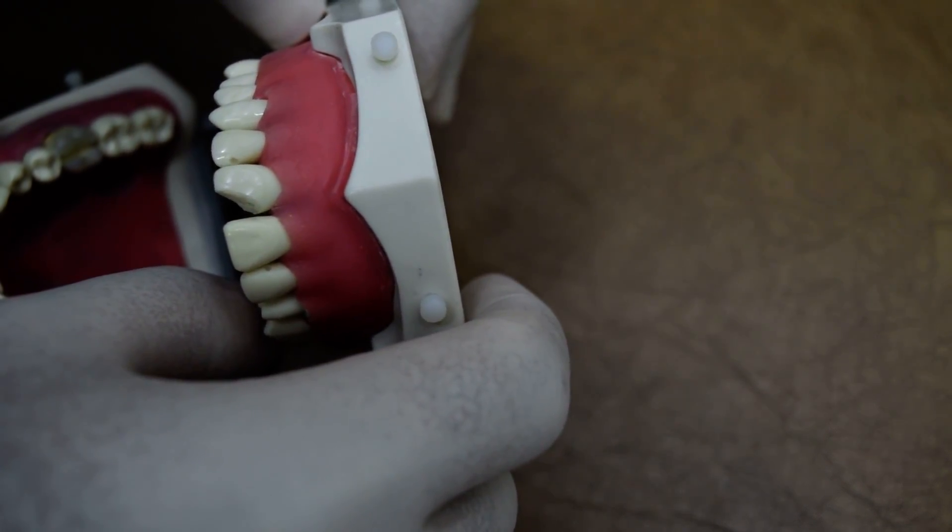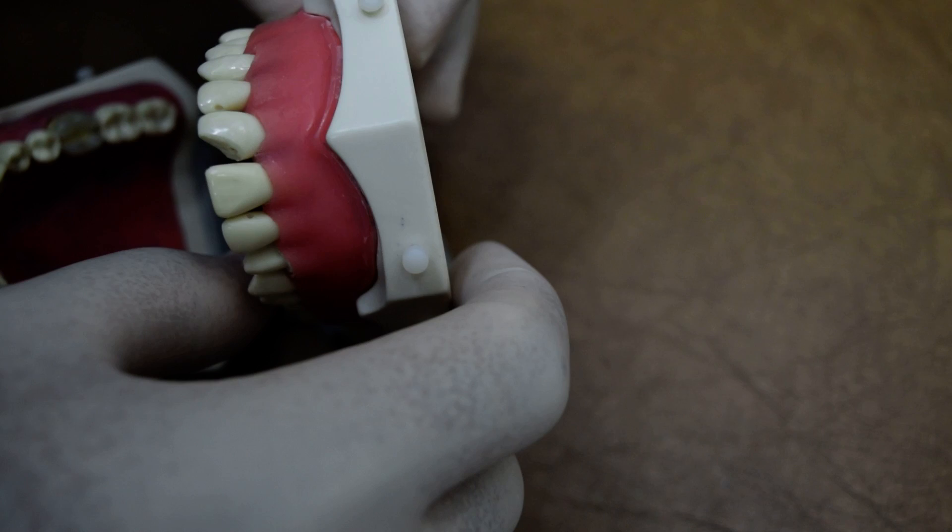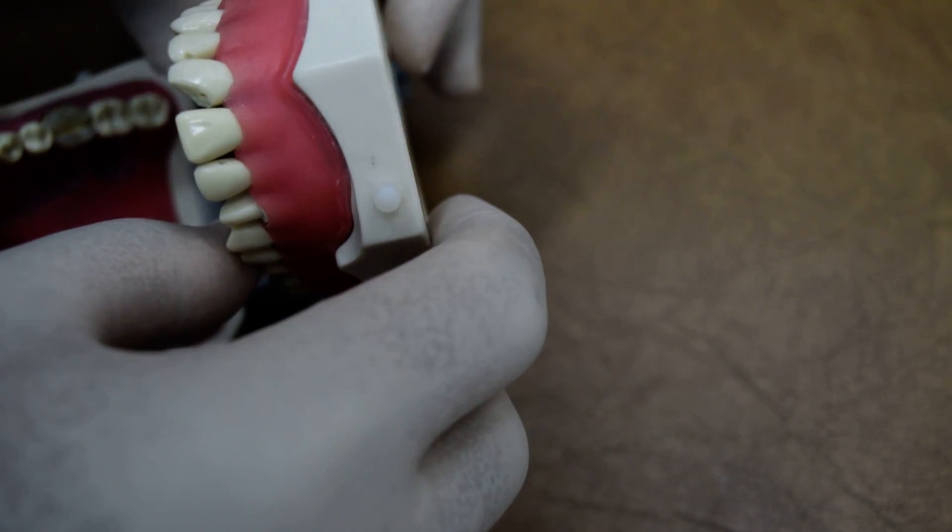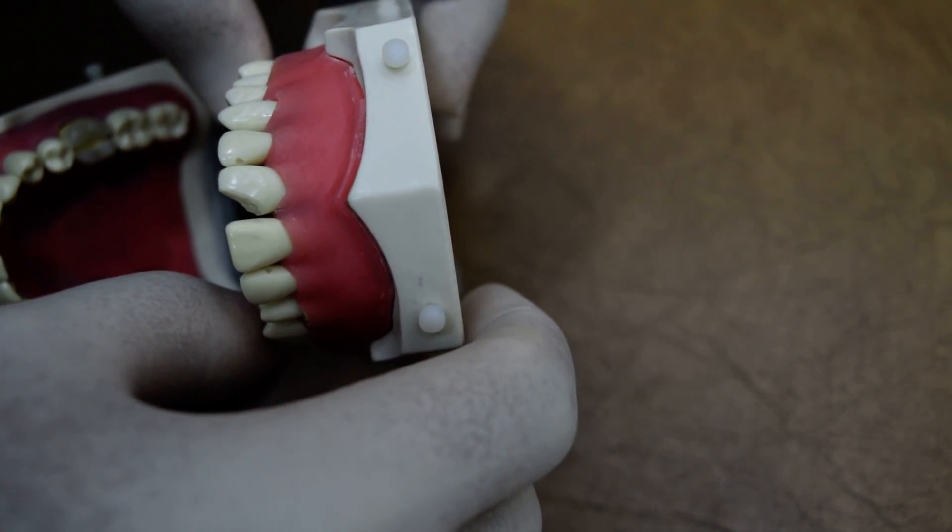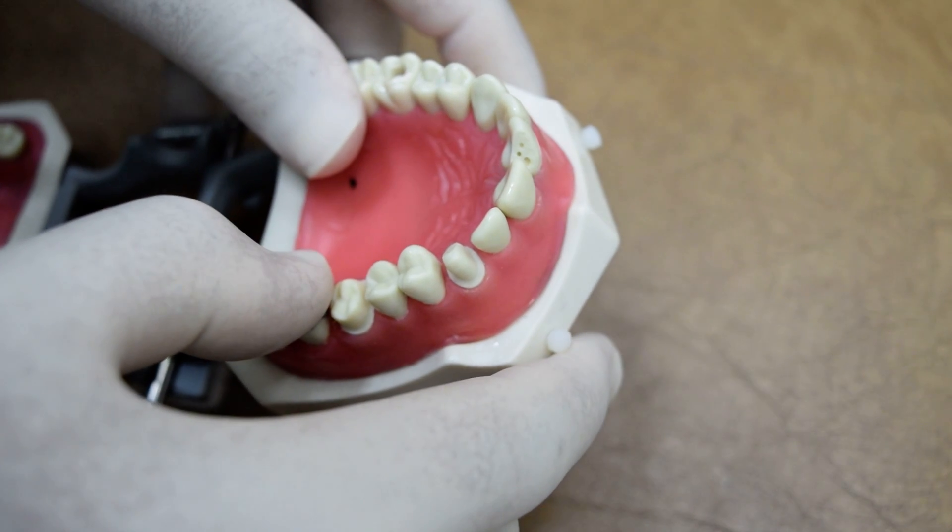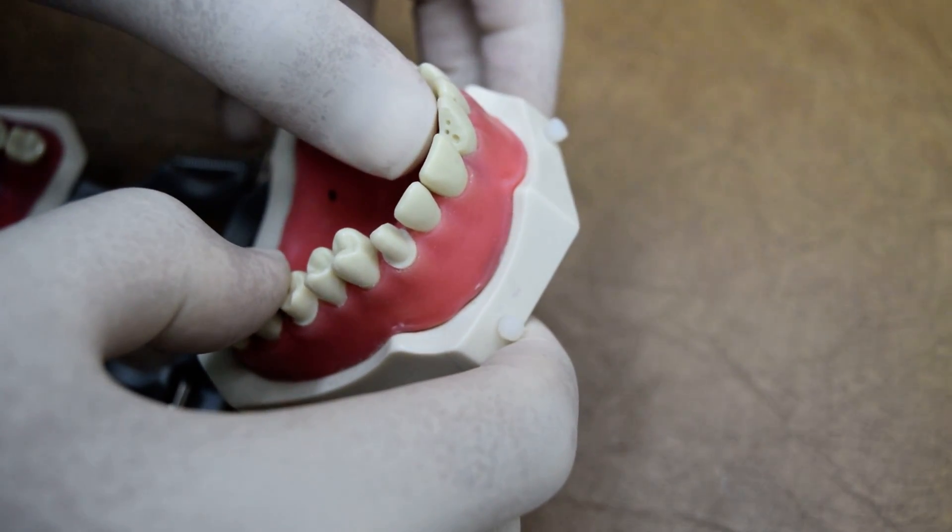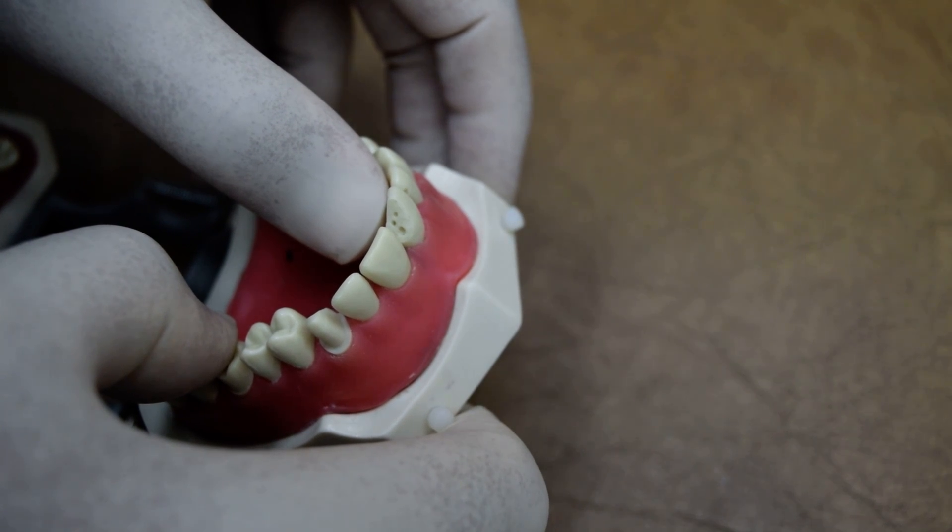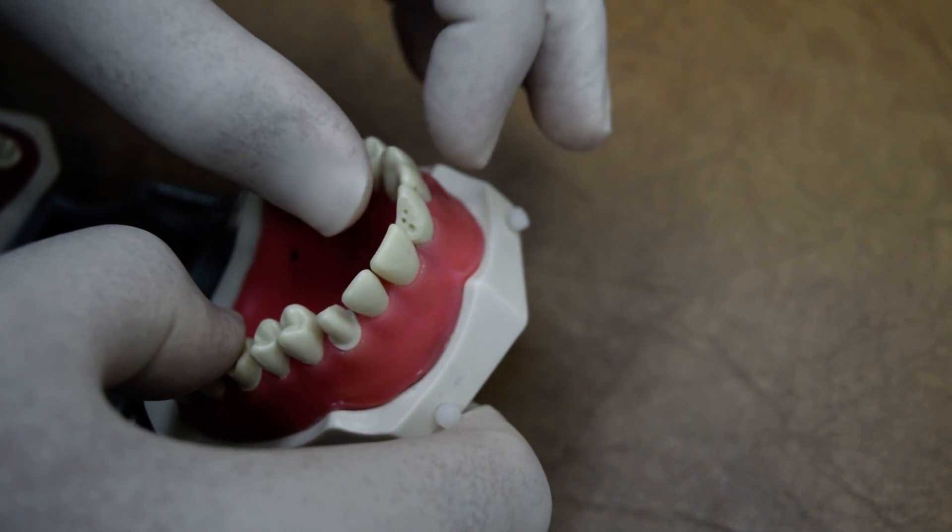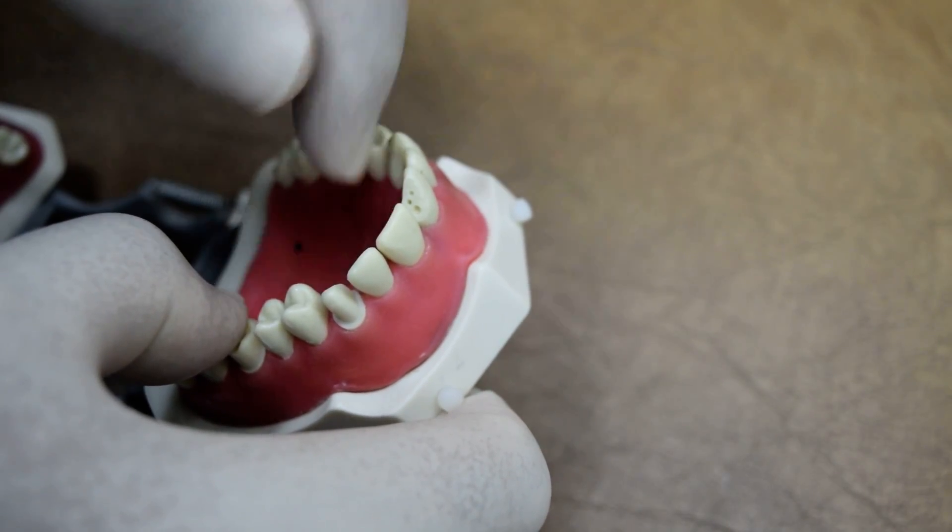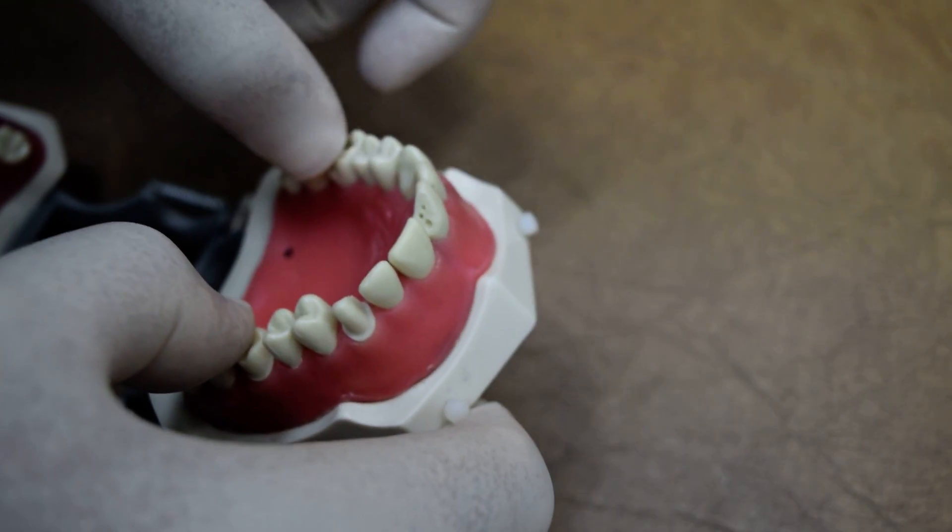For composite restoration class 4, first of all the cavity in the exam is very smooth, so we need to do retentive means. As you can see here, there are three grooves I did on the axial wall.